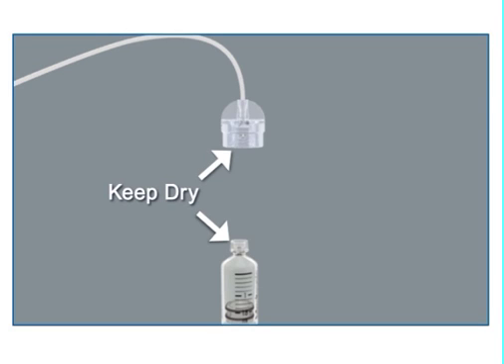Now connect the infusion set to the newly filled reservoir. Make sure both the top of the reservoir and the connector are dry before connecting them. Liquid can temporarily block the vents on the tubing connector, which may result in the delivery of too little or too much insulin, causing hypoglycemia or hyperglycemia. If any liquid has gotten in the top of the reservoir or inside the connector, start over again with a new reservoir and infusion set.